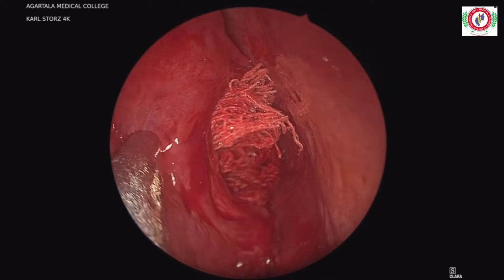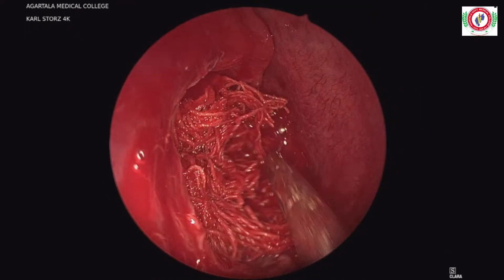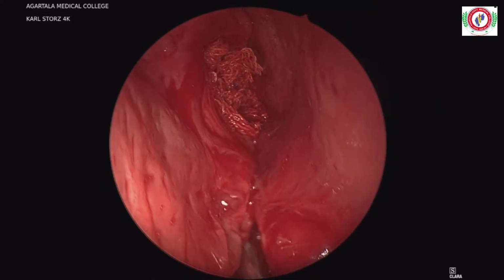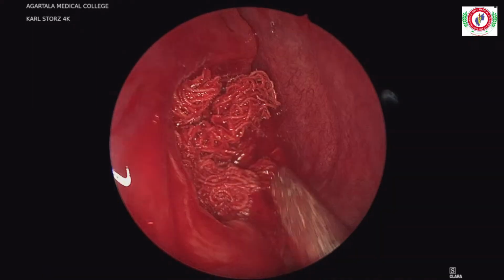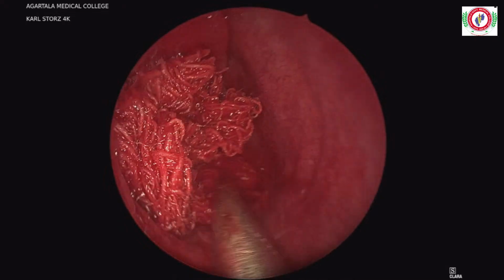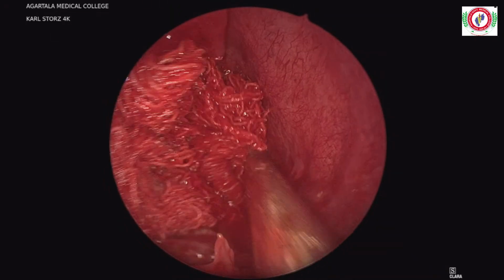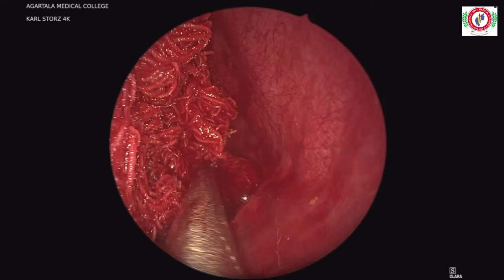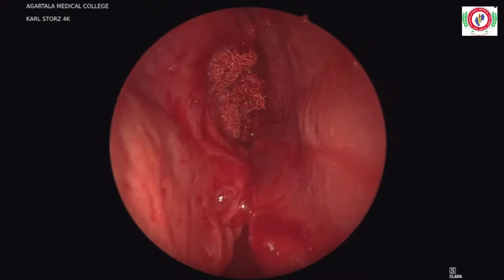I don't exactly know what is the endoscopic pre-lacrimal approach, but as the name suggests, you do endoscopic here. You remove the lacrimal bone and then you remove the disease from the maxillary sinus. Okay, so maybe in that way you may preserve the part of the inferior turbinate there.